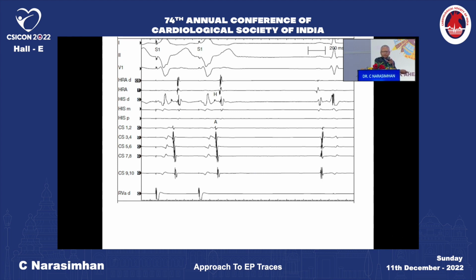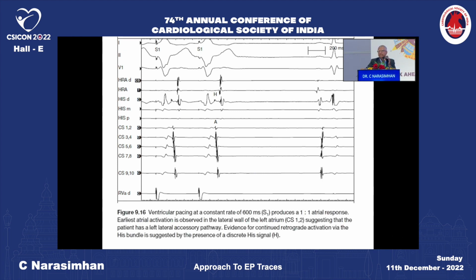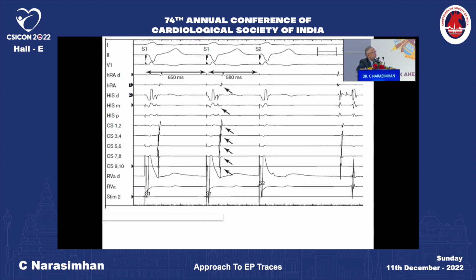Yes or no? So this is just, I'm not trying to say everything in EP, just to give you a bird's eye view that it's not all that complicated. Only thing is you need to devote some time to understand what's going on.